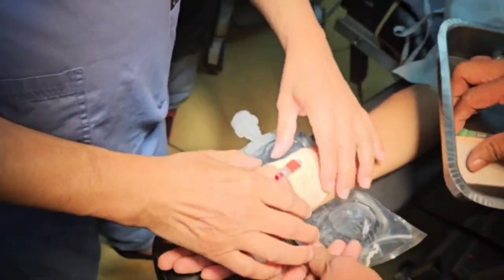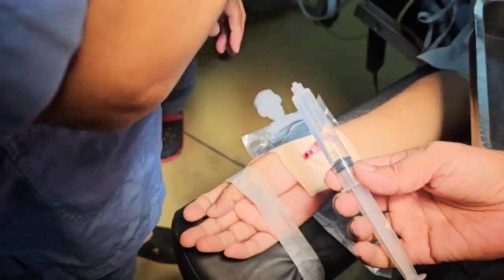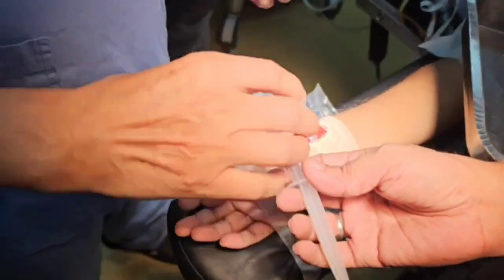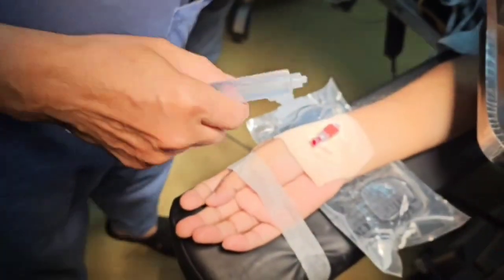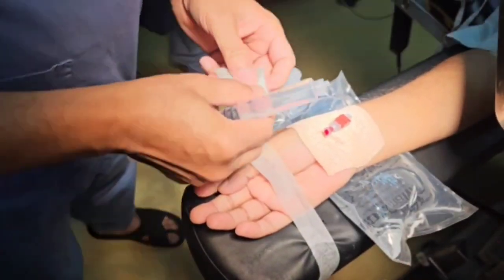Here we are seeing good securing of the radial arterial line and a gush of arterial blood pulsation in the heparinized solution.